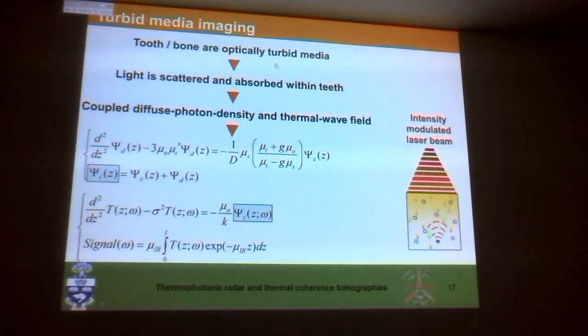There's somebody at the University of Windsor in Ontario who is actually producing a dental diagnostic based on ultrasonics. I think that's a problem because a lot of times, depending on the pressure that you're putting on the sample, the signal changes. There are lots of people who try to do acoustics on this, but it does not work very well because your definition of how much pressure to put on the contact is different from his definition, so sometimes the signals change.